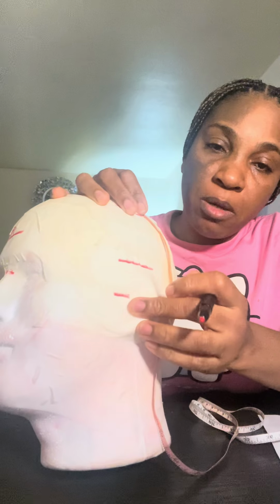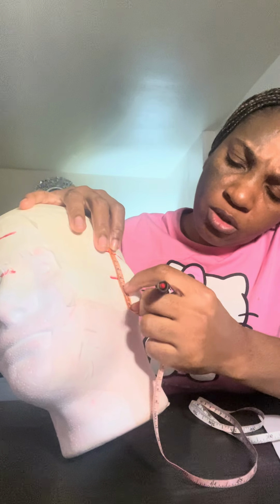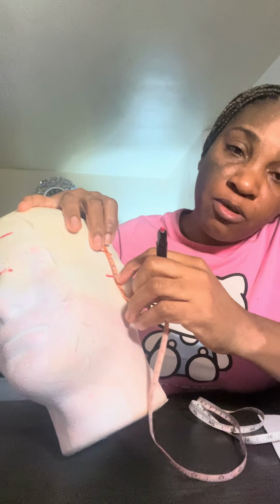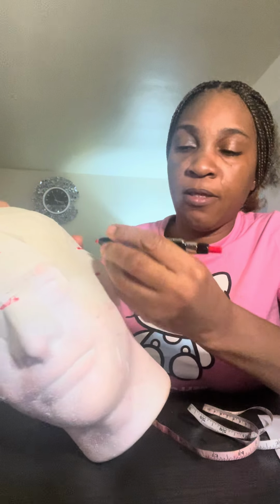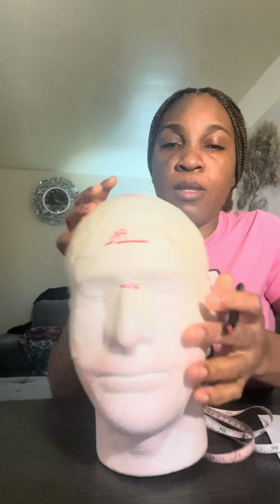From my T4 to my preauricular right is going to be 10%. So you can measure it to be sure, which is 3.4. So this is my T4. I'm done with my coronal measurements. Okay, you can see.